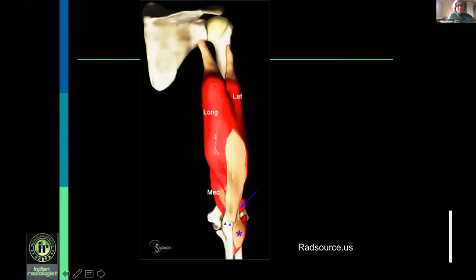The triceps has three heads: long head, lateral head, and medial head. The long and lateral heads unite together to form a tendinous head which attaches to the olecranon. The medial head forms a muscular head which attaches to the olecranon anterior to it. On the sagittal, you have the tendinous head formed by the long and lateral heads, and anterior to it the medial head inserting as a muscular head. You can therefore have a tear involving only the tendinous head, only the muscular head, or involving both.